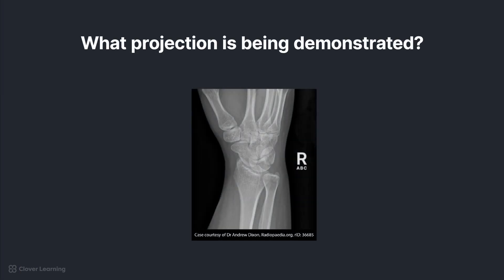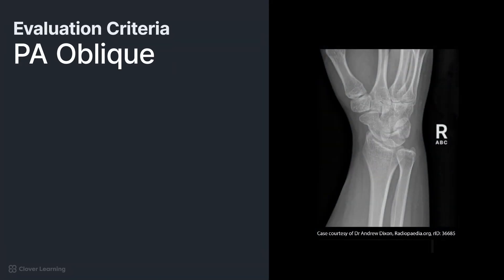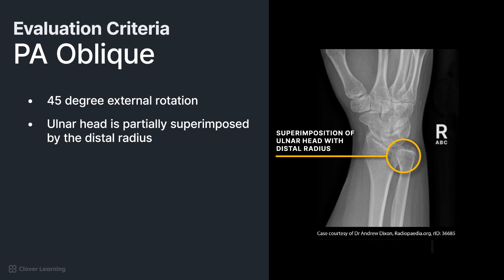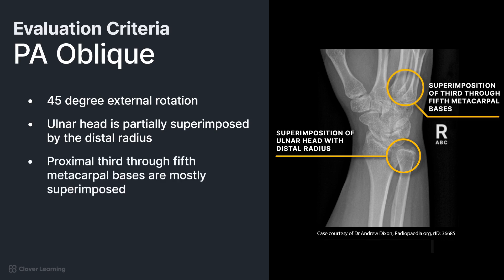What projection is demonstrated in this image? Which direction was it rotated? This is a PA oblique projection of the wrist with 45 degrees of lateral rotation. It is external or lateral rotation because it is being rotated away from the median plane of the body. We know it is a true 45-degree oblique because the ulnar head is partially superimposed by the distal radius, and the proximal third through fifth metacarpal bases are mostly superimposed.